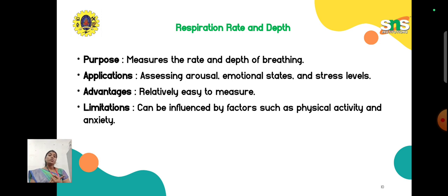There are also limitations. For example, physical activity and anxiety will interfere with the original result of this technique. If the person is having an investigation or interrogation, and has had to walk a certain distance, several kilometers, and climb stairs, and is then attending the interrogation or investigation, the physical activity done before the investigation will interfere with the respiration rate.